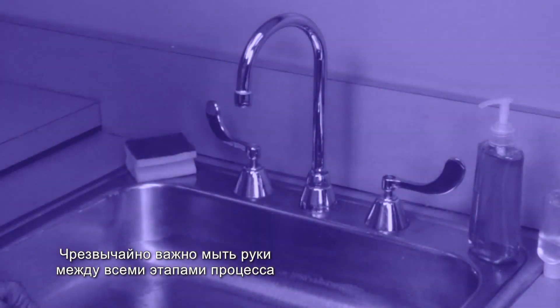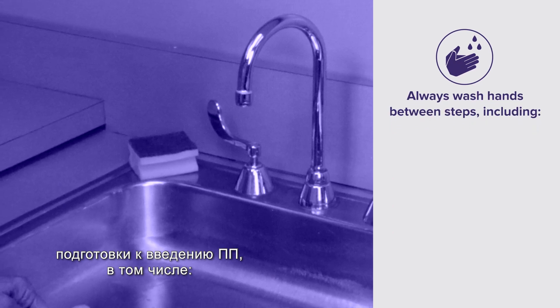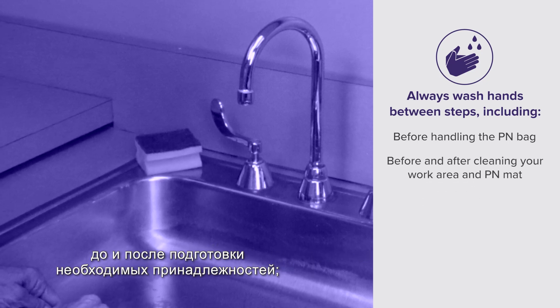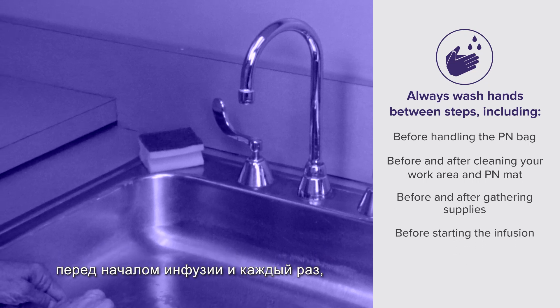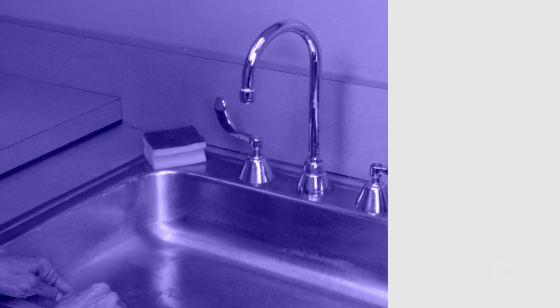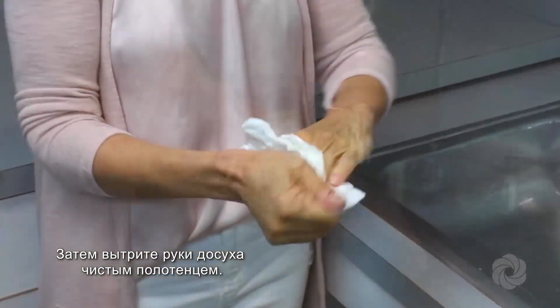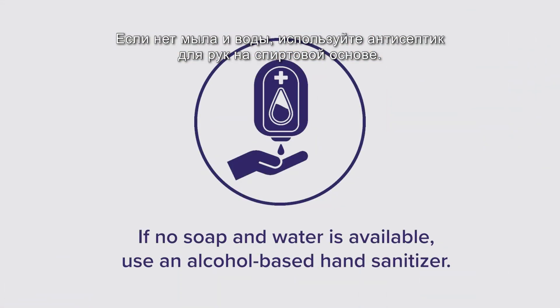It is very important to clean your hands between every step of the PN preparation process, including before handling the PN bag, before and after cleaning your work area and PN mat, before and after gathering supplies, before starting the infusion, and whenever you think your hands may have become contaminated. Clean hands thoroughly using soap and warm water, followed by drying with a clean towel. If no soap and water is available, use an alcohol-based hand sanitizer.